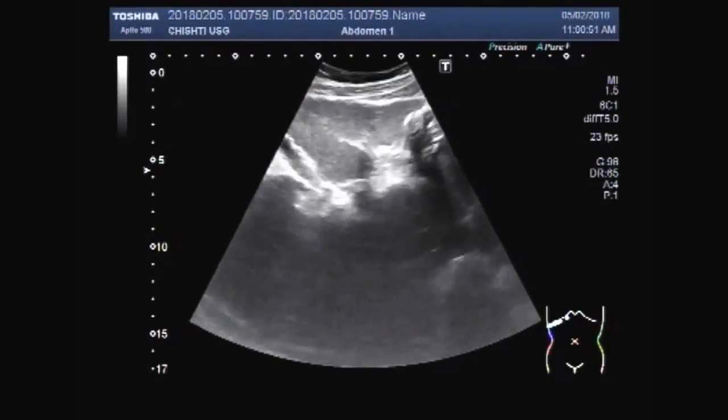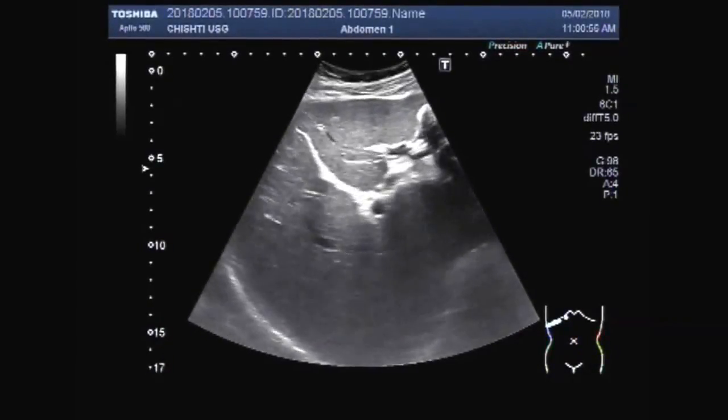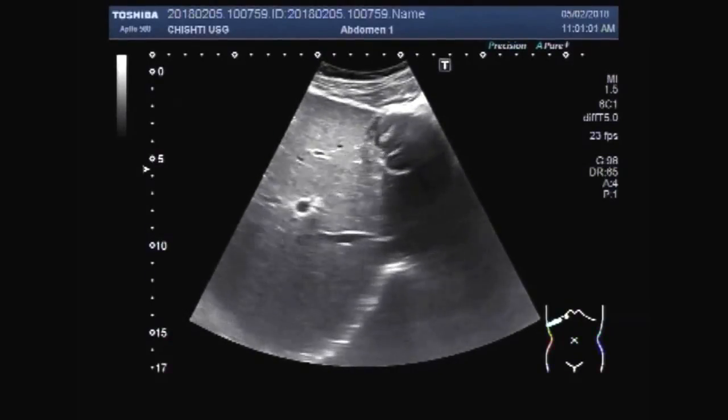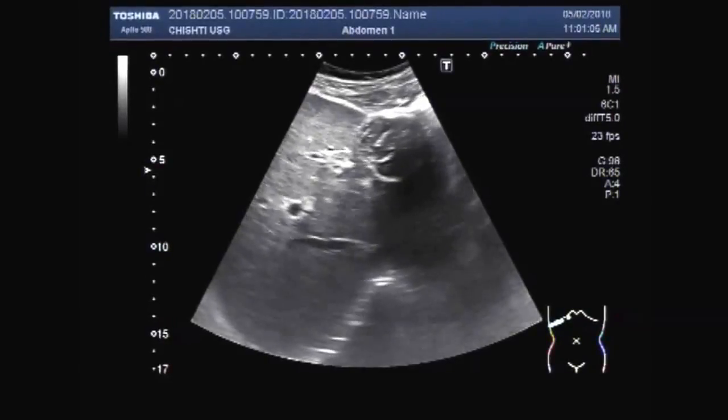Dear viewers, I hope you are all fine. This ultrasound video shows a mass — a hydatid mass in the upper and inner portion of the left lobe of the liver.